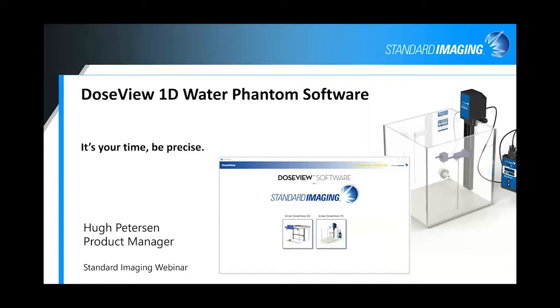But today I'm going to be focusing on the software improvements and basically what is a ground up rewrite to the software. If you have any questions on the hardware itself, feel free to either contact me. I'll have my contact information at the end of the presentation, or you can contact your regional rep by checking on our website for our rep finder. But today, let's move into the software.